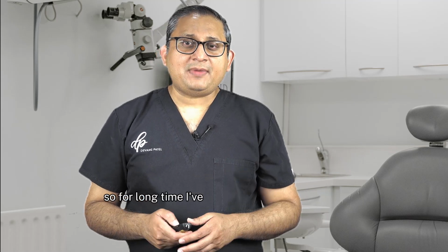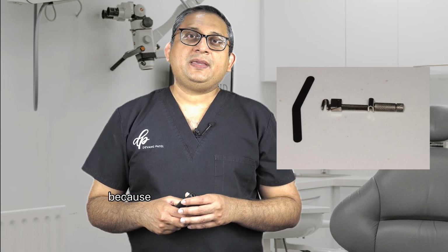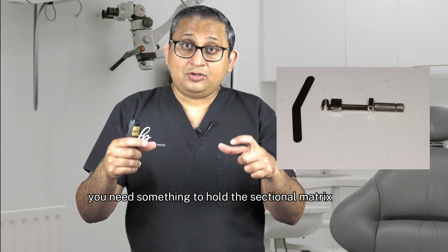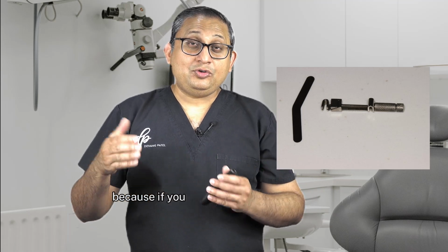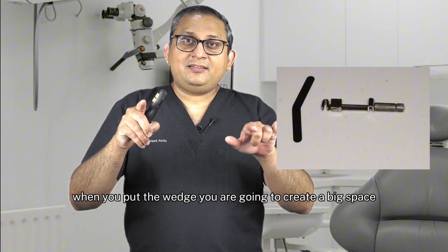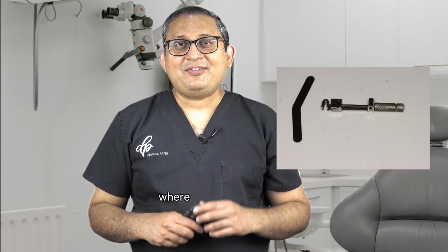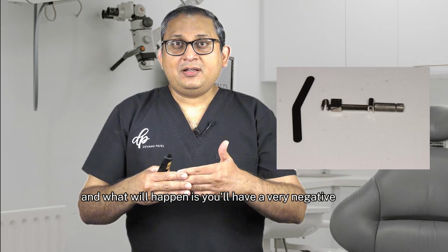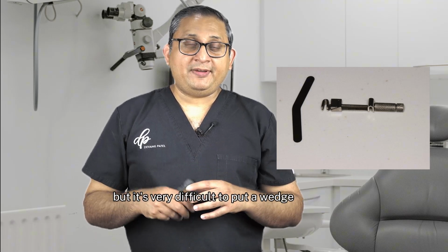So for a long time I've used the Tofflemire matrix band. Sectional matrix bands are very tricky to use because by definition they are small and sectional. You need something to hold the sectional matrix band, and many times the wedge will hold it, but again it's difficult to do that because if you are coronal to the box when you put the wedge, you are going to create a big interdental space when you do the composite restoration. I'll show you a case when I show you tip number 3 where the dentist did that. What will happen is you'll have a very negative ledge, and I'll show you in a minute what I mean by that. But it's very difficult to put a wedge in there.